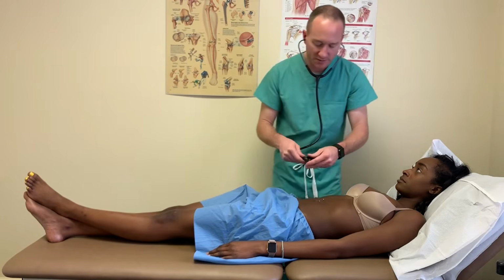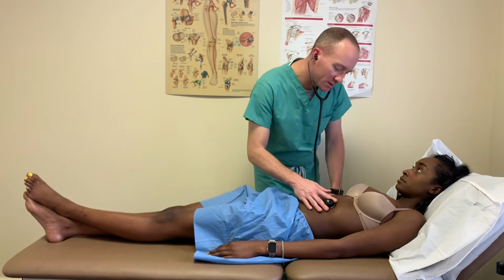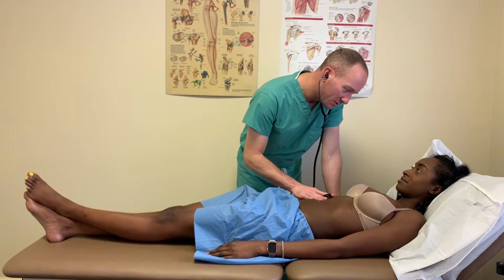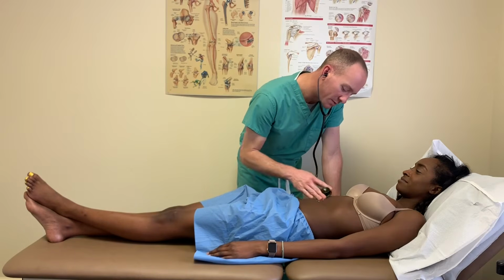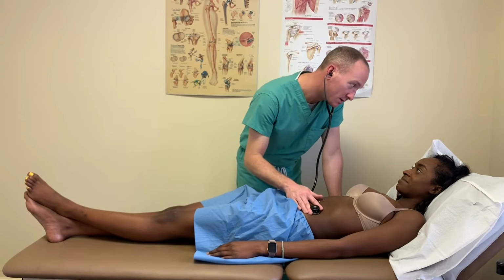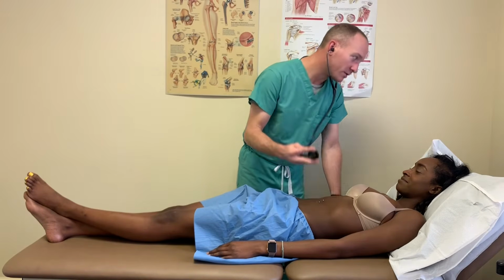Okay, going to flip to the diaphragm. We're going to listen in all 4 quadrants for bowel sounds. Present immediately in left upper, right upper, right lower are present, and left lower. Very good.